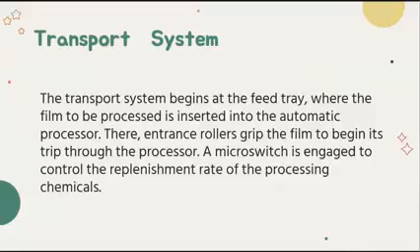Okay? So, kailangan na even ang ato ang pag-feed sa film, no, in the automatic processor, so that the replenishment rate is maintained, no, which will be discussed also later, what is the replenishment rate for both the fixer and the developer, and also proper wear and tear of the transport system components, no? Parang equal ba ang paggamit, no, sa mga rollers, sa mga guide shoes, ano good.